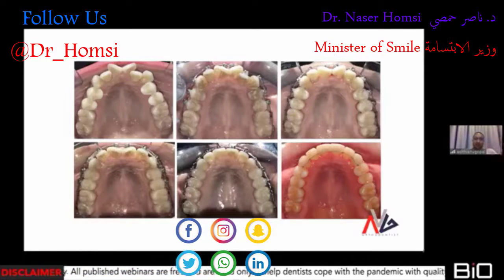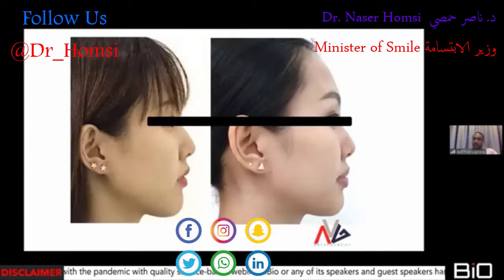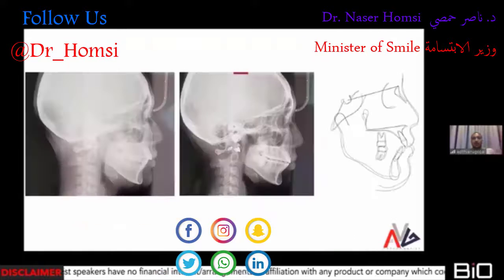They flared out, there was an open bite, and I had to do a lot more interproximal reduction. A lot of elastics were used. And finally, I was able to get a decent finish, no doubt. Even the profile has moved forward. The lips have moved forward, but still within the range in terms of patient satisfaction. She was still satisfied with the outcome.